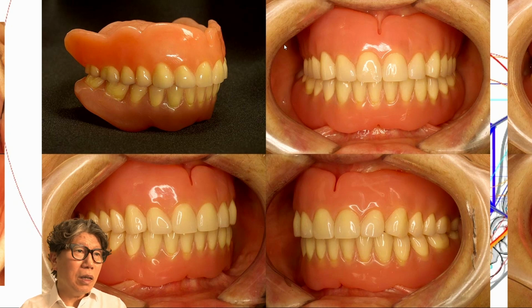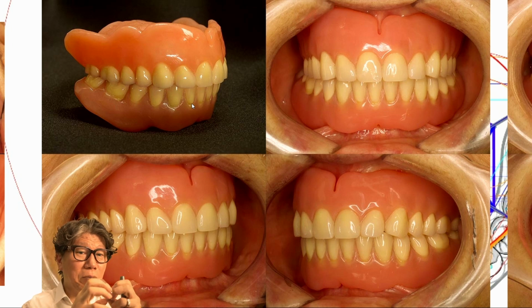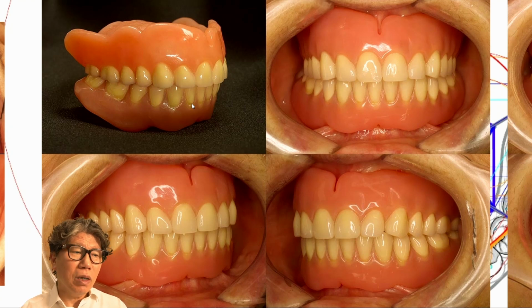There is currently no grip strength in the upper and lower dentures. When pressed together like this, it should become 3-dimensionally stable and locked. If this moves or if you slip, then he won't put that in his mouth. It's no use trying, and it only leads to conflicts with patients. So I absolutely do not do it. If you put it in your mouth like that, then the centric is firmly set.